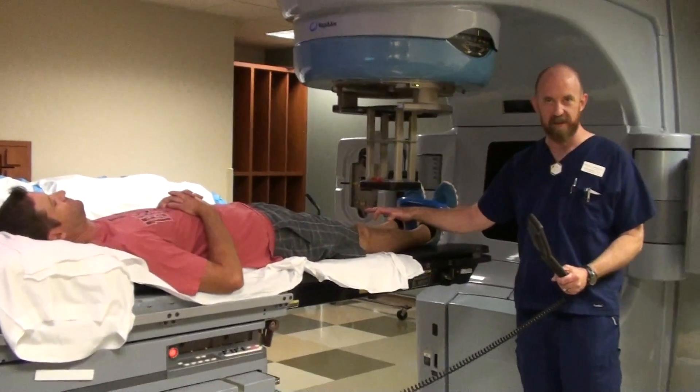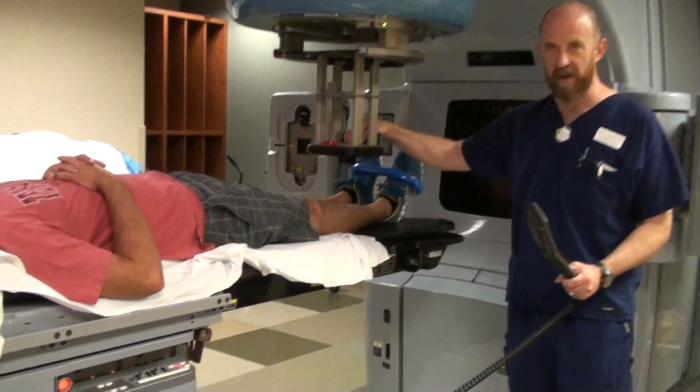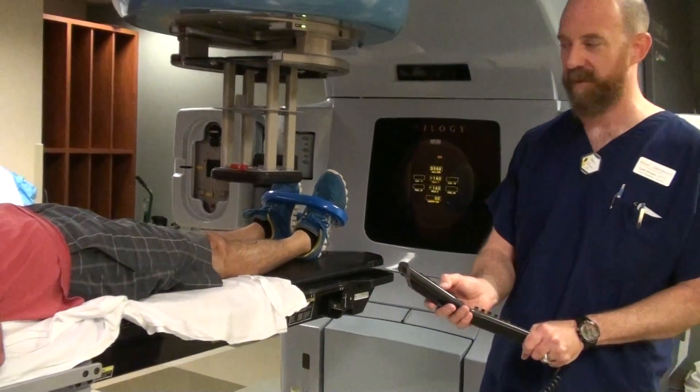You're going to have some marks on the patient's skin, an electron shape, and you're just going to line them up. You're going to have the light field and the circle line up together. One's a little bigger than the other right now simply because of divergence.